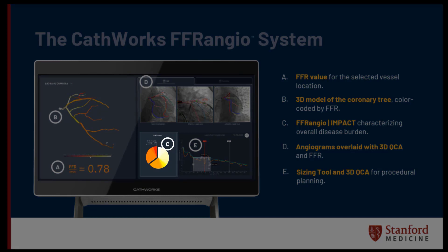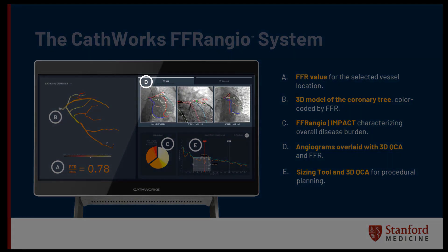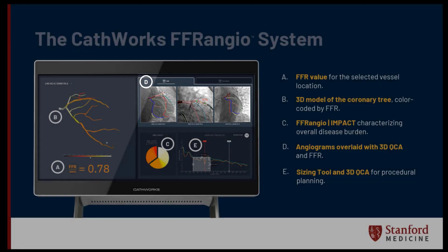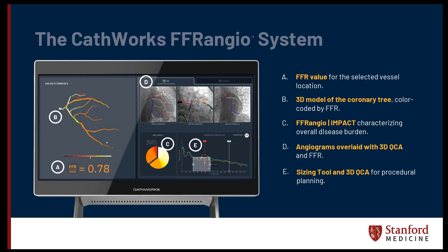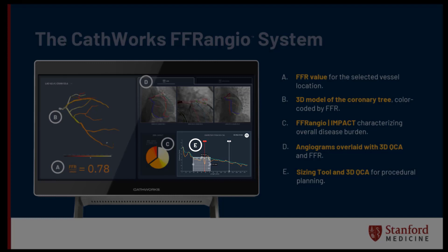The color pie chart depicted by C is the impact score, which characterizes the overall disease burden and extent of myocardium impacted by the abnormal FFR. Above those three panels, you have the angiograms overlaid with QCA and FFR to help correlate what you're seeing angiographically with the physiological assessment — an overlay of what you routinely see on your screen. Finally, and very excitingly, the newest generation software includes the sizing tool and 3D QCA, which is incredibly helpful and can be adjusted to tell you what size and how long a stent should be placed.